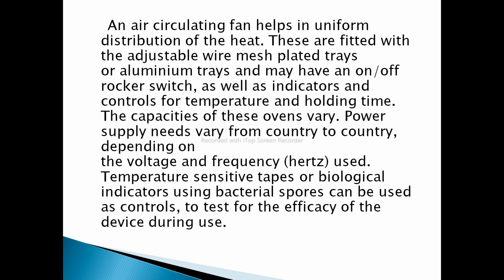There are temperature indicators. The power supply needs to vary from country to country depending on the voltage and the frequency. Some temperature sensitive tapes or biological indicators are also used. Bacterial spores are used as controls to test the efficacy of the device during use.